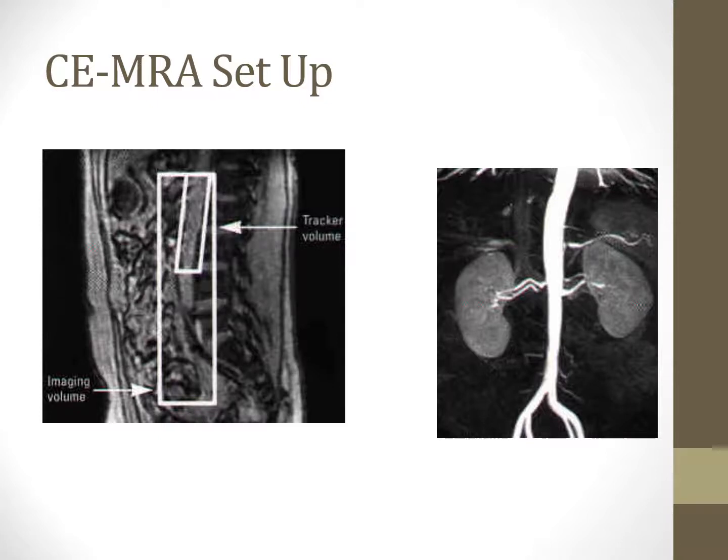And so basically we're going to be sending in an RF pulse and tuning for that until we actually have the change in the T1 times that the system can obtain as it's going through this setup process. When it detects the bolus is reaching the volume of interest, then the scan will be triggered and the images will be completed. Beautiful process.